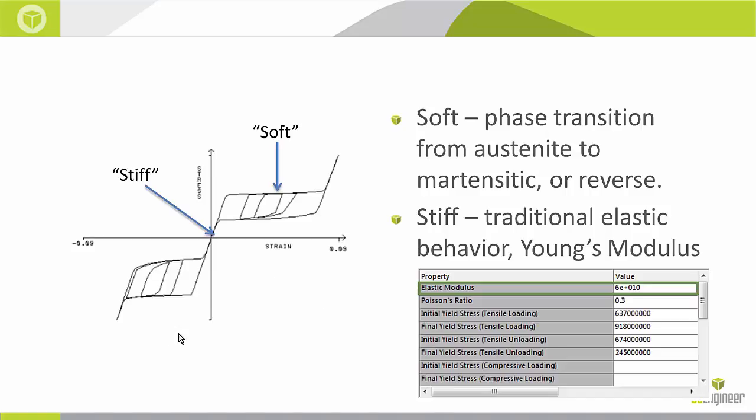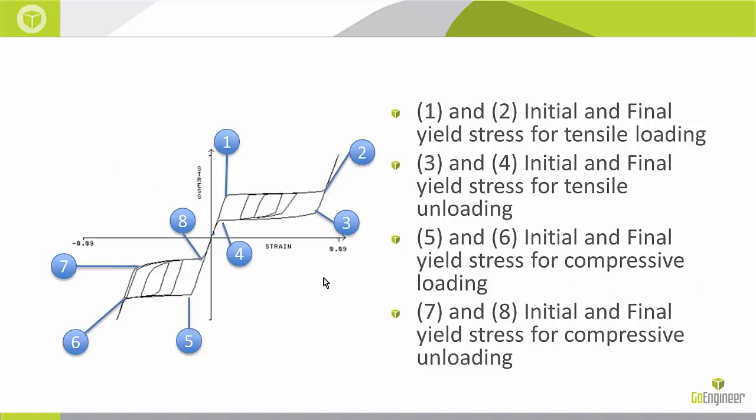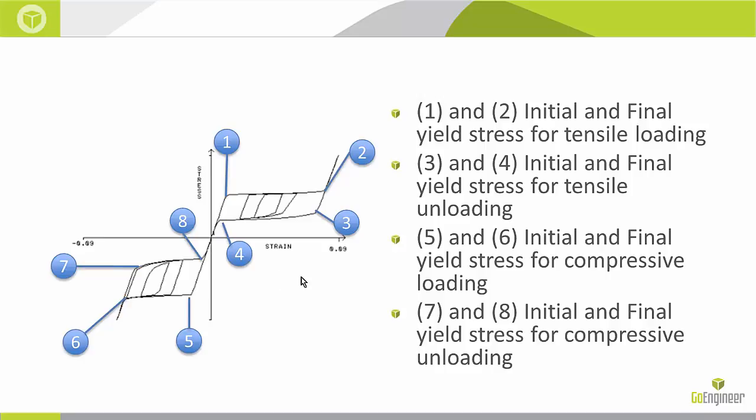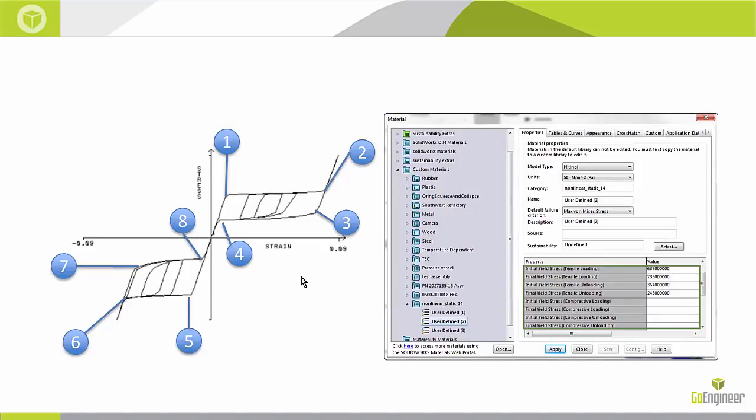In order to properly define a Nitinol material model like this I do need eight separate data points. These are going to be the yield stress data points at each of the inflection points of this curve. Following the balloons here we can see that there are four different yield stress points for loading and unloading in tension. The same goes for compression. Each of those data points are input into SOLIDWORKS.